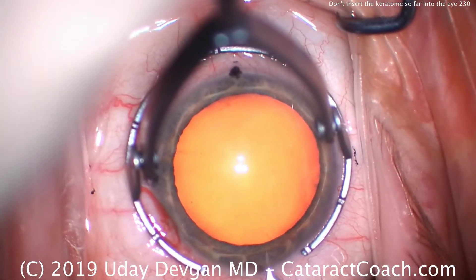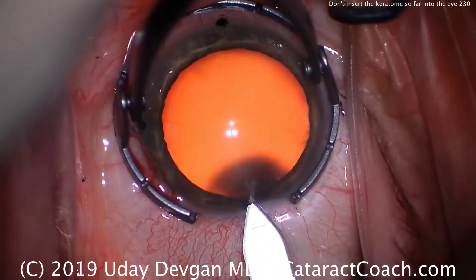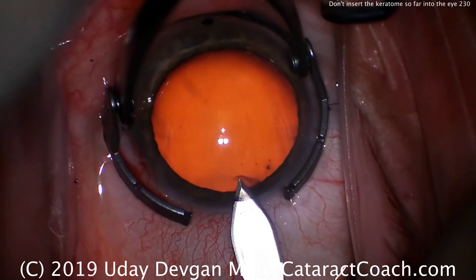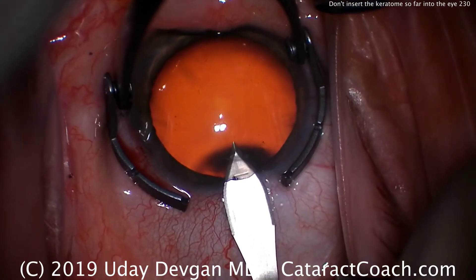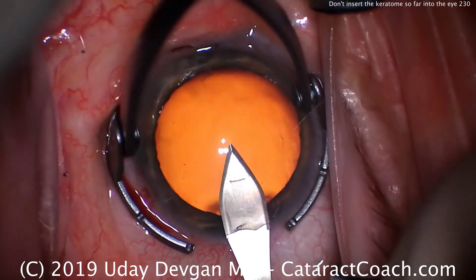Let's show you again — a good incision. There's the keratome tip. Start to advance it. There's the line on the blade for guidance. Slowly advance, piercing Descemet's right about there, till the widest part enters the anterior chamber. And then out.